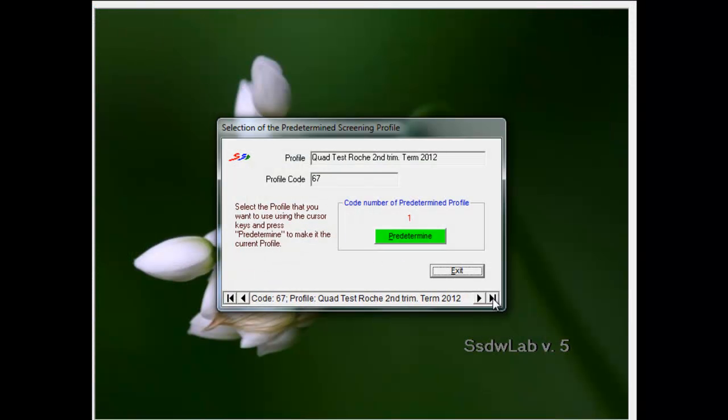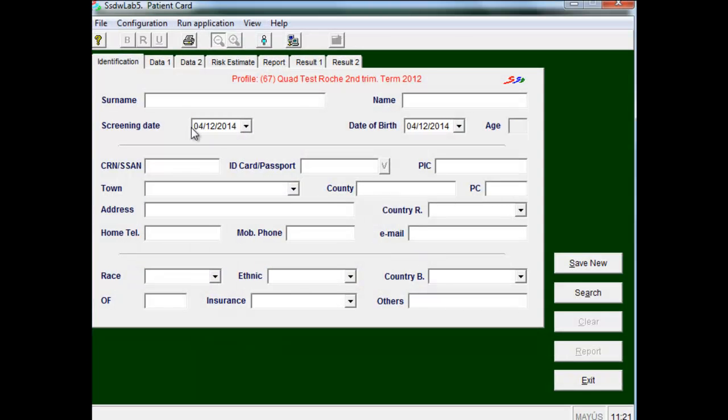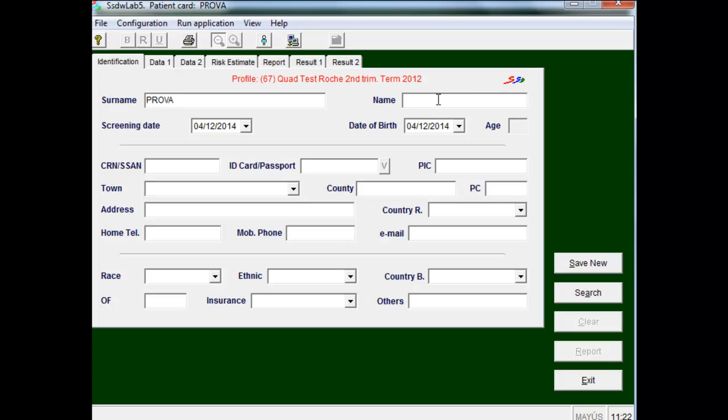Here we introduce the name and surname of the patient, which are two essential conditions. Also we have to introduce the screening date, that is the date of blood sample extraction. Another imperative condition is date of birth, which will give us the age of the patient at the screening time.